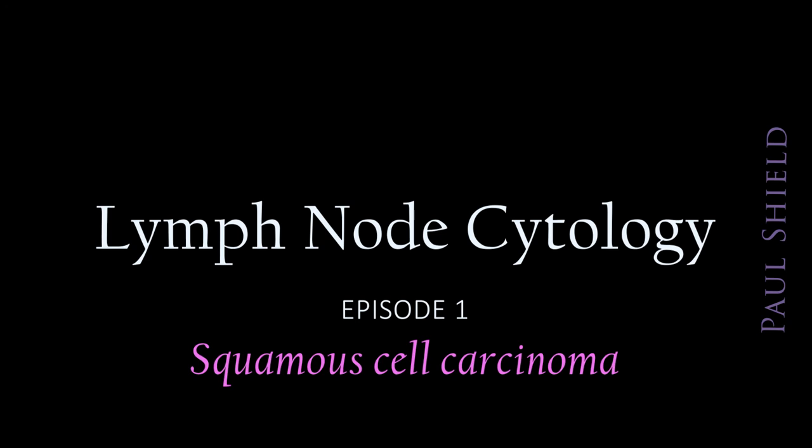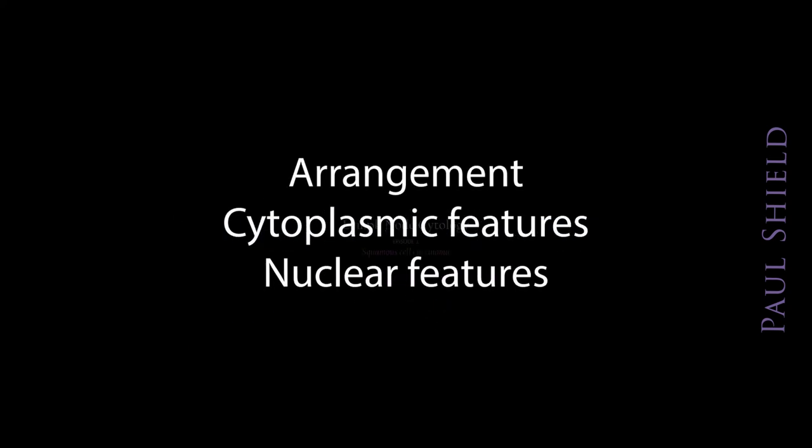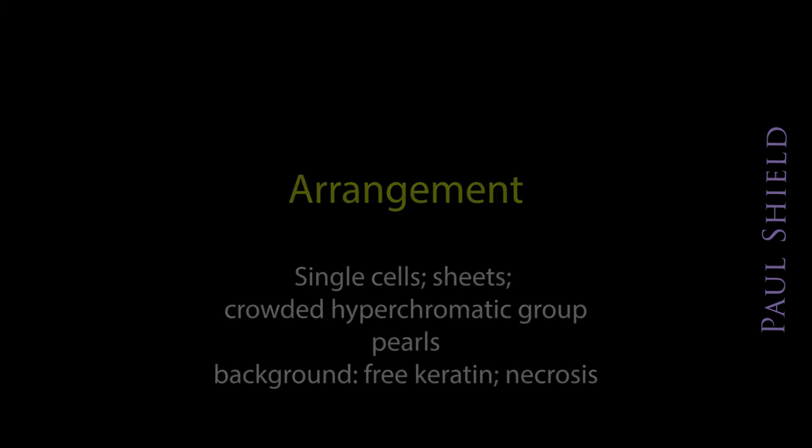Hi, it's Paul. Let's look at squamous cell carcinoma and its generalised features in cytology specimens. So we'll look at the usual features and how they're expressed in SCCs.